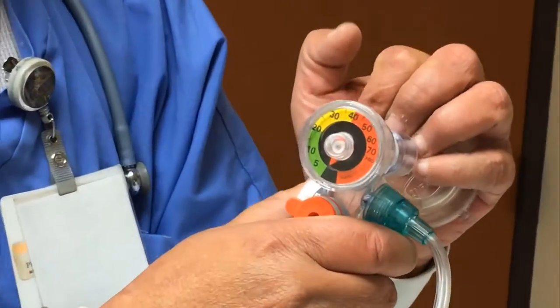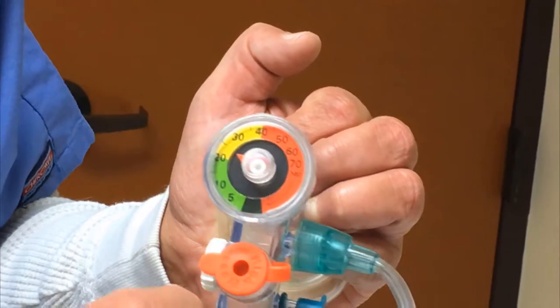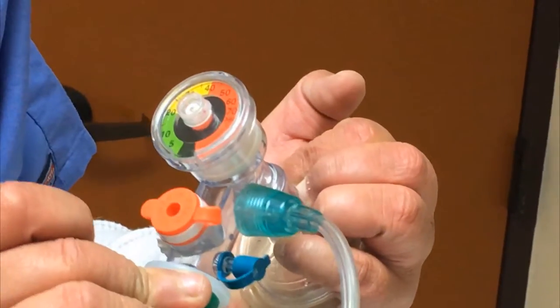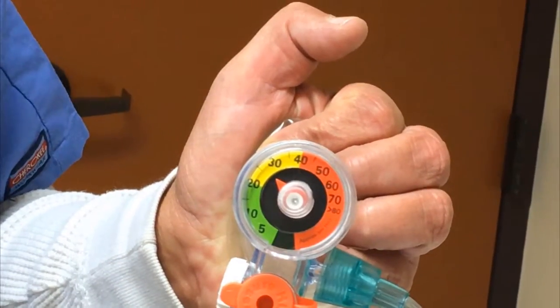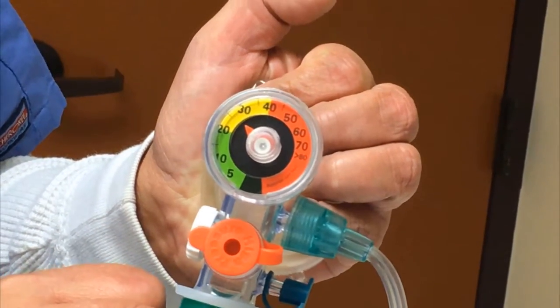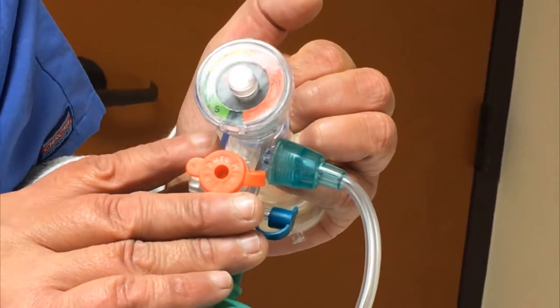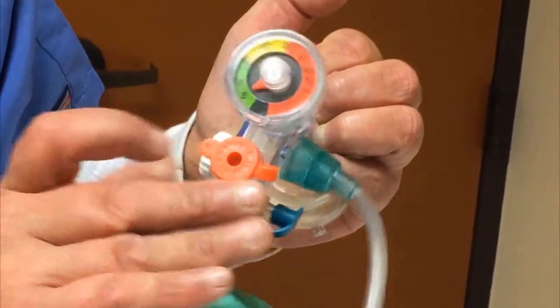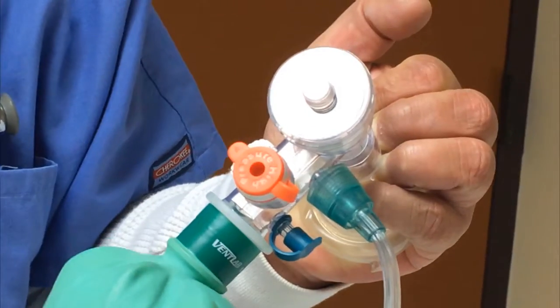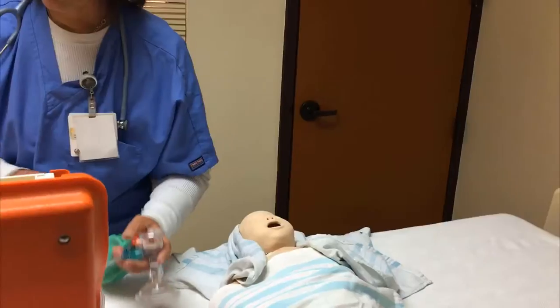So we occlude the mask, and if you look at the manometer, it's going all the way up to 25 centimeters of water pressure. But we want to start our PEEP at 5 because we're just wanting to slightly inflate the lungs between expiration for babies who are having trouble breathing on their own.